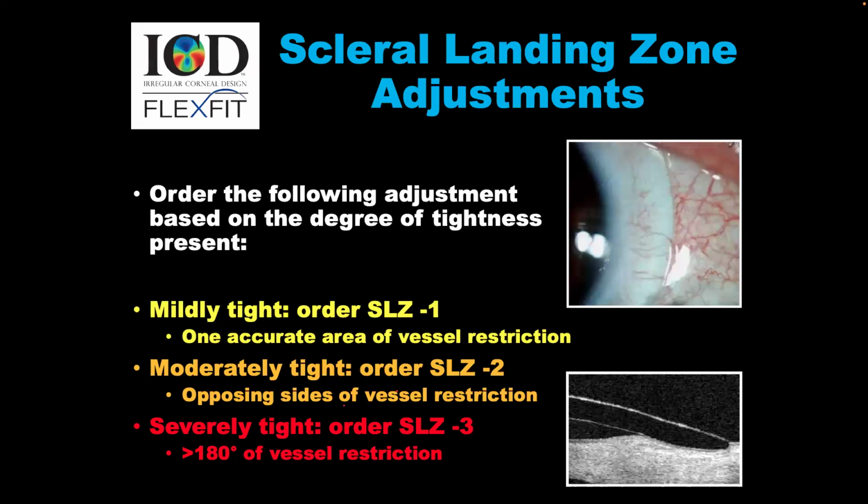And if we see those 3 and 9 and the flat meridians being at 3 and 9, we may likely do better with increasing toricity in this particular case. As well, if the lens rotated and the markers were at 6 and 12, and we saw a little bit of blanching, then we have a scleral toricity against the rule. But if we see some blanching at 6 and 12 and the markers are at 3 and 9, then decreasing the toricity will make it better.